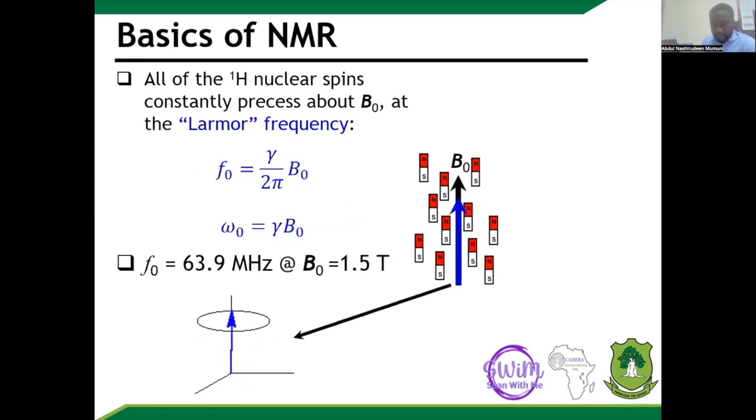Yes, it's about 64 megahertz. Forget about the equation at the top here. It's just giving us the expression for the Larmor frequency. We are technologists, so I wouldn't want to touch so much on theory. Our focus is on the precessional frequency of the spins as the human body is inside of the scanner.